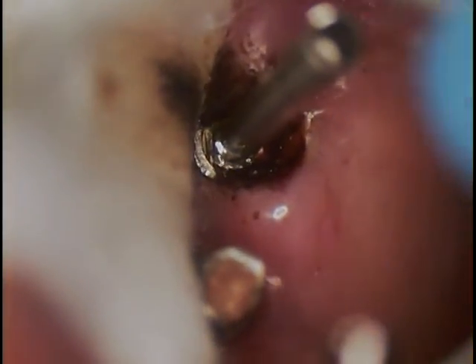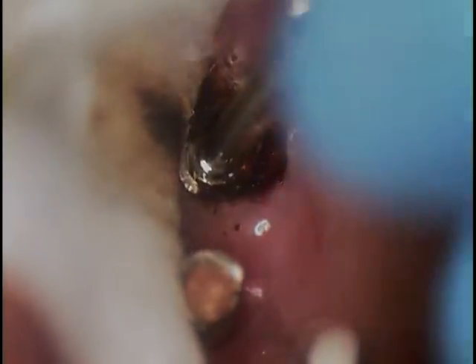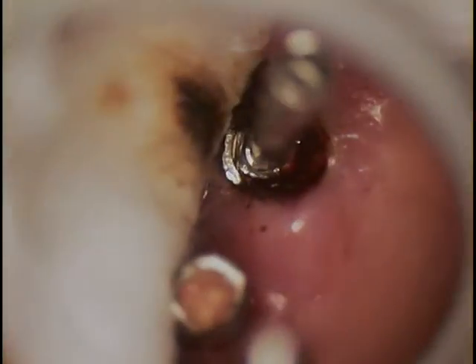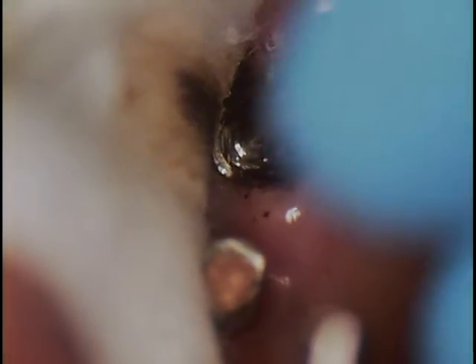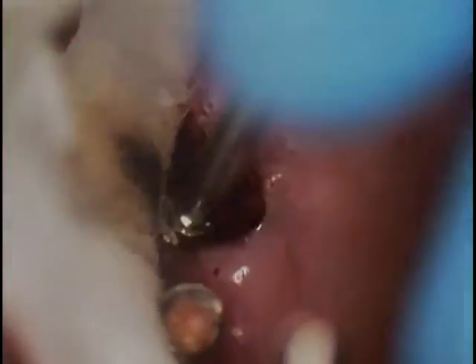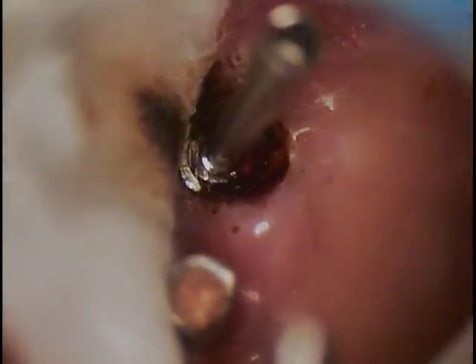That's about as far as it's going. We're going to measure the length. I have a hunch it should go just a little bit more, but that might be it. It's at least down to the first thread of the screw itself. You can probably tighten that down.